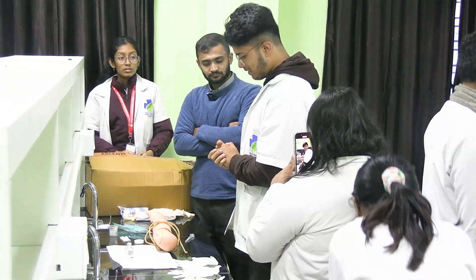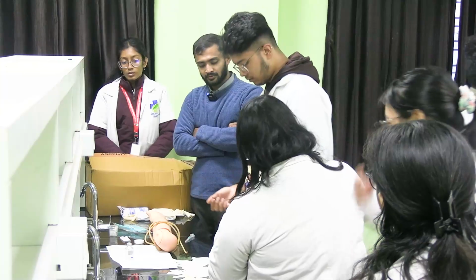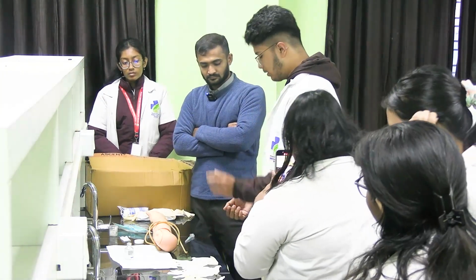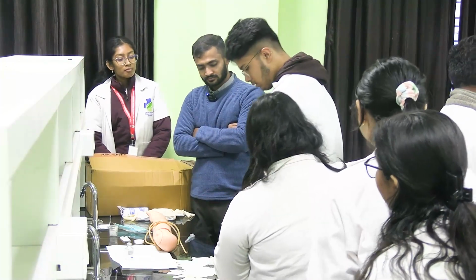After sterilizing my hands, sir, then I'll wear this. How will you wear? Sir, the sterile part is the outer part. So I'll be using my non-dominant hand to touch the inner part, and I'll be inserting. Show me.